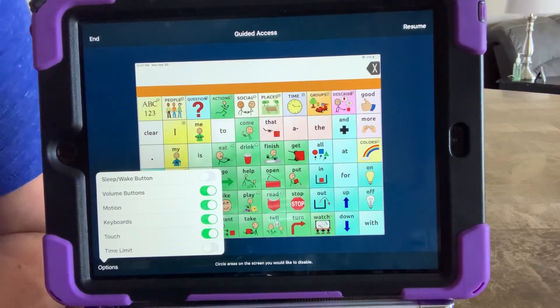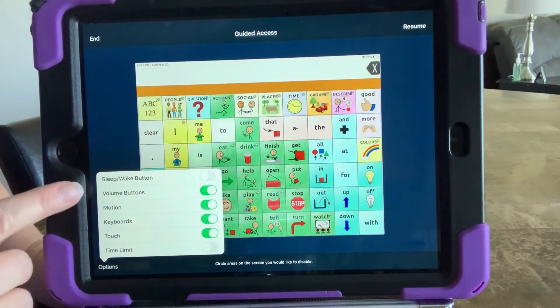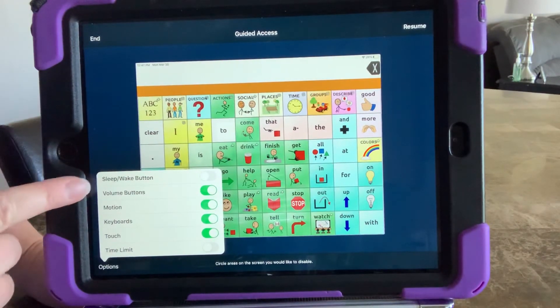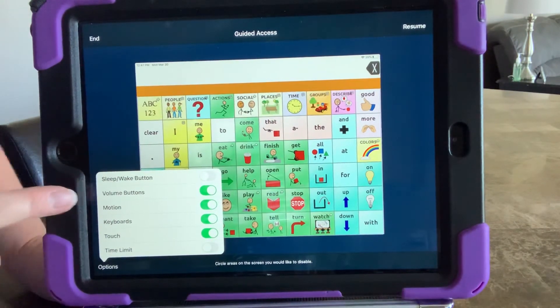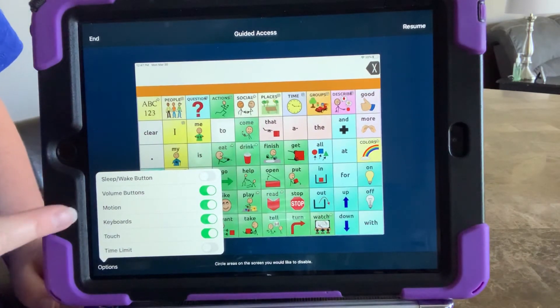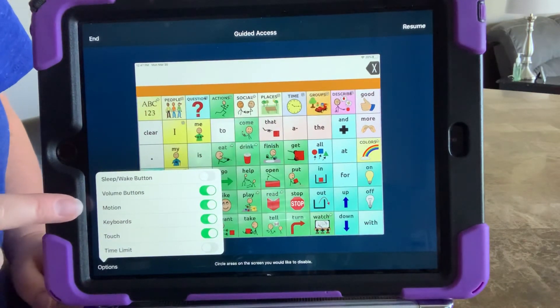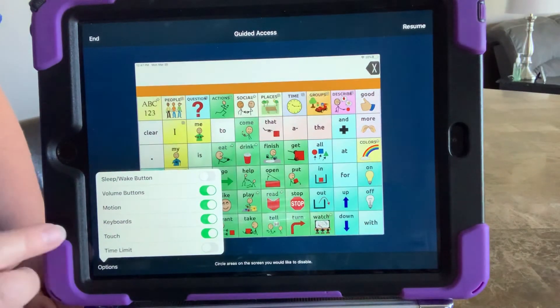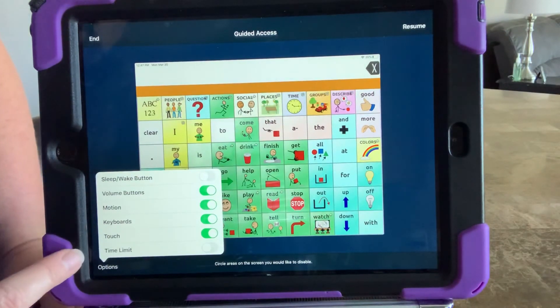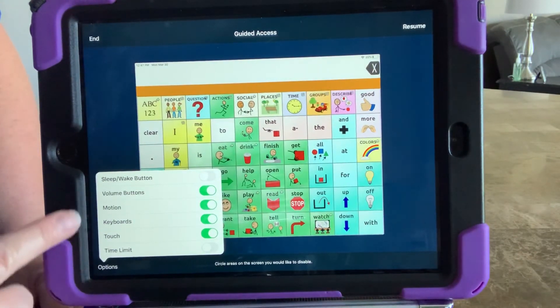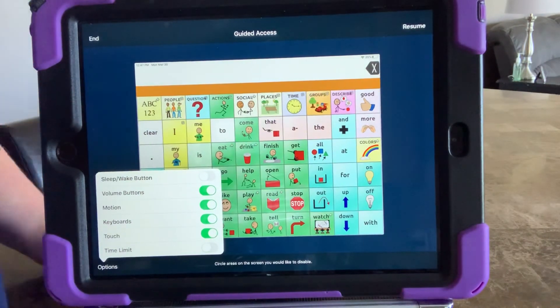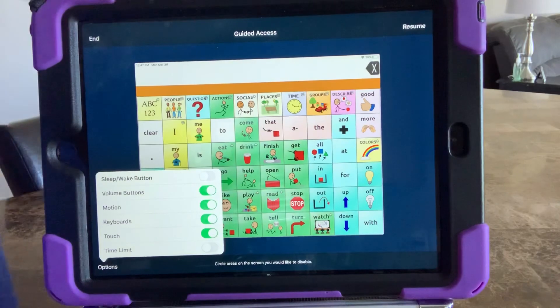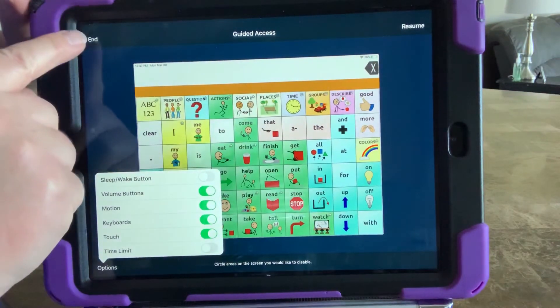There are other features in here as well — for example, volume buttons. I tend to leave it so that individuals can change their volume when needed. Motion means it's locked in one position; I like to leave it free to rotate. Just know there are other options in here for you to look through. Anyway, that's how you get in and out of guided access — I hope that was helpful!